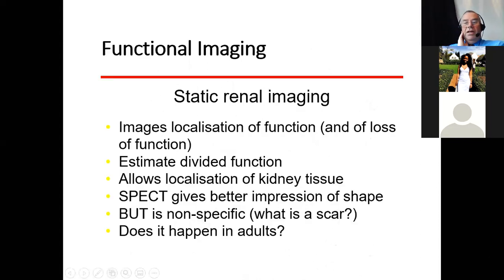What about static renal imaging? Images really localize function or loss of function. It's the best way to assess divided function because it doesn't depend on the injection technique or the immediate uptake curve that you do with a renogram. You can get a better, more accurate divided function.